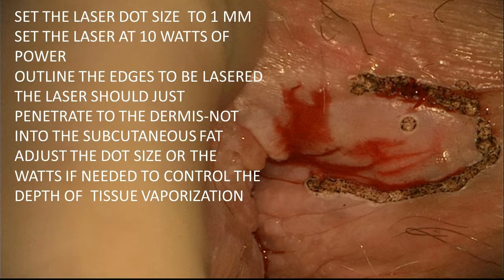Outline the edges to be lasered. The laser should just penetrate to the dermis, not into the subcutaneous fat. Adjust the dot size or the watts if needed to control the depth of the tissue vaporization.